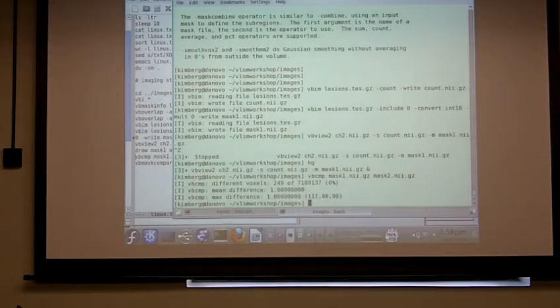And one thing that I really encourage when you're doing image analysis is constantly double checking on everything you're doing, and when possible doing things more than one way, because it's very easy to get disoriented with image data, no matter how long you've been doing it. You're frequently managing lots of different files, lots of different dimensions, and lots of different processing streams, some of which may be interrupted partway through, and so on. So repeating analyses and trying analyses different ways and making sure that they can be repeated easily is especially important.